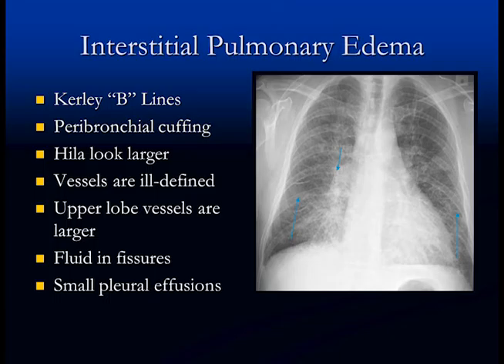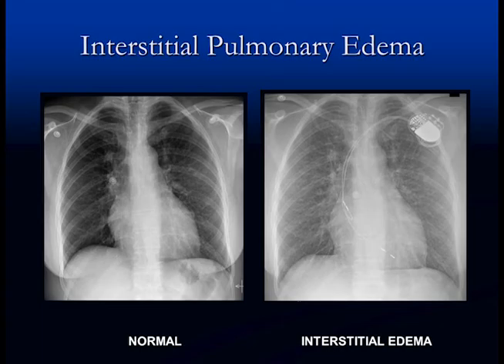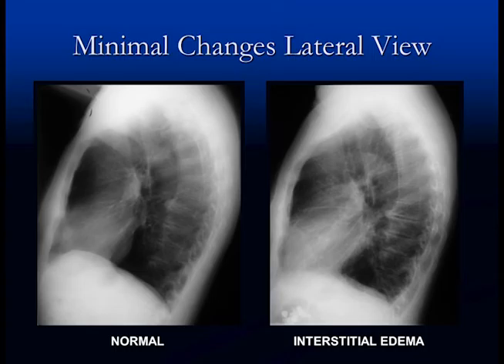As edema progresses we start to see more lines and different changes. We get Kerley B lines — perpendicular lines due to fluid in the interlobular septa of the lung. We get peribronchial cuffing visible in the hilar regions, and fluid in the fissures as well. All the hila are big, the vessels are ill-defined and indistinct. This is interstitial pulmonary edema.